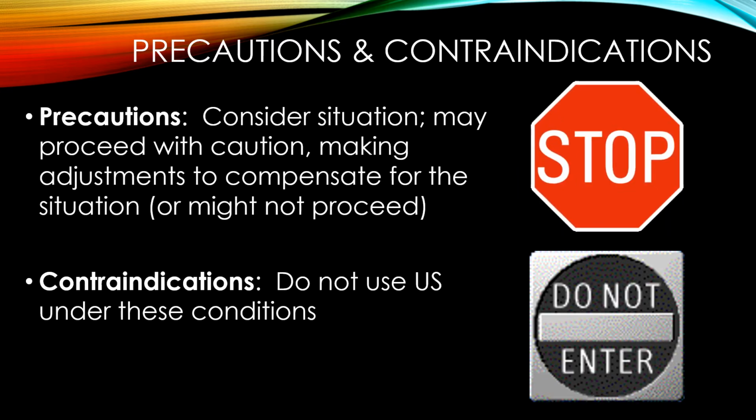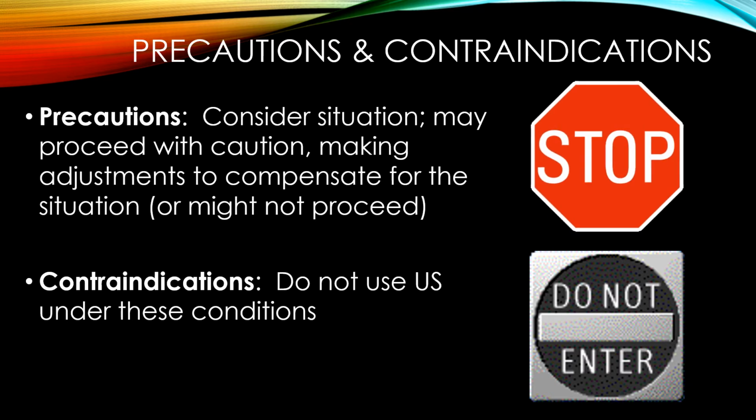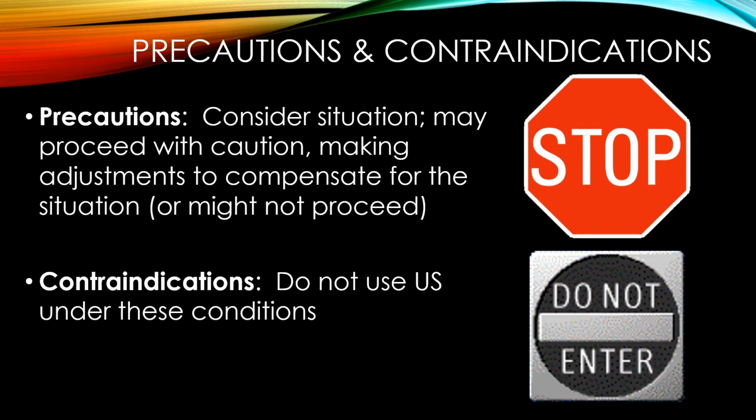Contraindications are like a do not enter sign. If you come to a do not enter sign, you simply don't go down that road. So if you have a client that has a contraindication to therapeutic ultrasound, you are not going to use therapeutic ultrasound under those conditions.